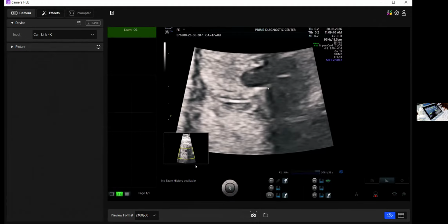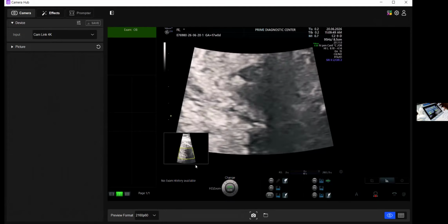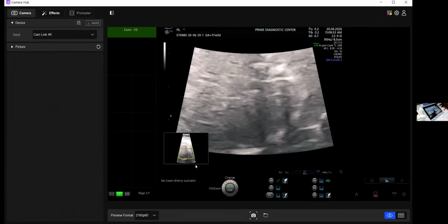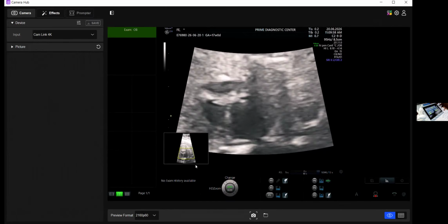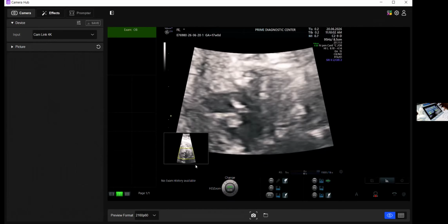So that is the right atrial appendage. It's a kind of a rounded structure. Okay, so that's the right atrial appendage. And then we go and try it, and maybe we'll try it some other patient. But I can tell you it's certainly very challenging to see the structure of the appendages. And I would honestly tell you, don't look for it.